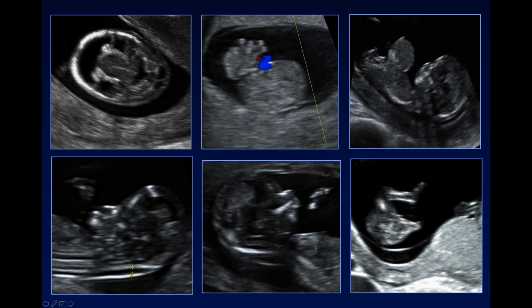When we look at the mid-sagittal profile, which is one of the landmarks we have to look at in order to measure our nuchal translucency or evaluate our nasal bone, we can look at the contour of the face, and this fetus has micrognathia. Again, if we look at the mid-sagittal view, you can see how abnormal this profile looks. It's flattened. There's an abnormal placement of the nasal bone. The palate is not seen. This fetus had a large facial cleft. So we can do an early anatomic evaluation of the fetus.